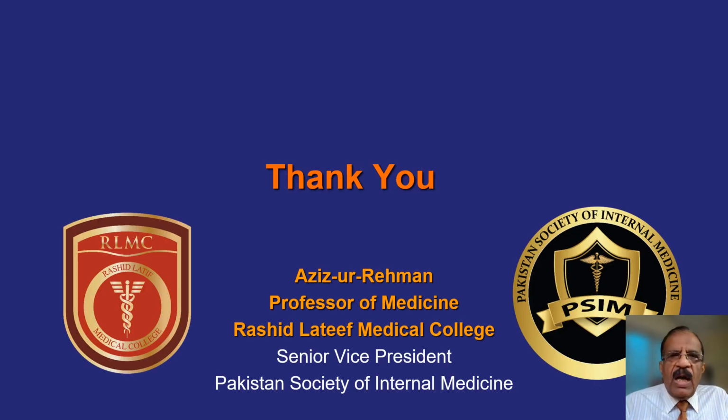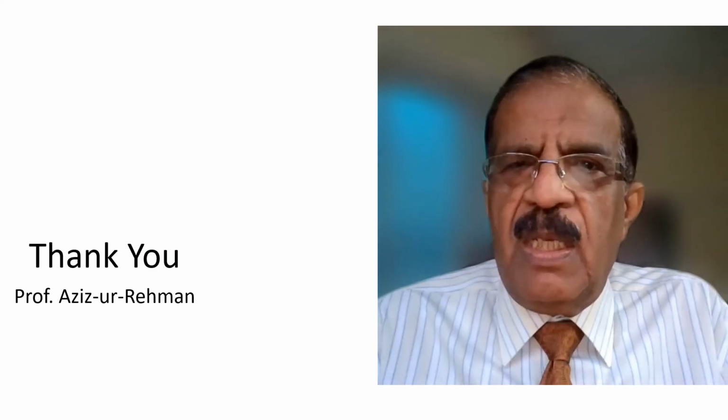So that was all. As I promised, this was a short video, just 15 minutes. So I covered atrial flutter. This is not a very common arrhythmia, but this could degenerate into atrial fibrillation, and atrial flutter and atrial fibrillation are both predisposed to thromboembolic phenomenon. So if you can identify and treat, you can serve your patient better. So I think that is why this video was included.